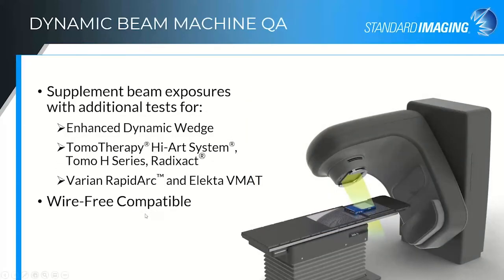So there are supplemental tests then, additional tests that you can do for your beams using this device for enhanced dynamic wedge, for all of the tomotherapy, the HI-ART systems, the H series and the Radixact, or for Varian or Elekta, RapidArc, or VMAT. All of these tests can be run in a wire-free mode or in a wired mode, and it's simply either defining these ionization chambers as a location and coming up with a treatment plan for them. In the case of the VMAT or the RapidArc, or in the HI-ART method, you can do both a static test as well. And I'll show you that one in just a minute.